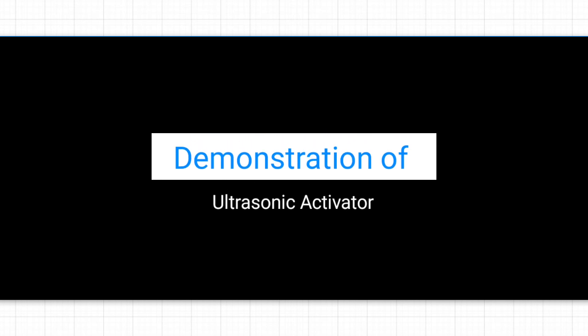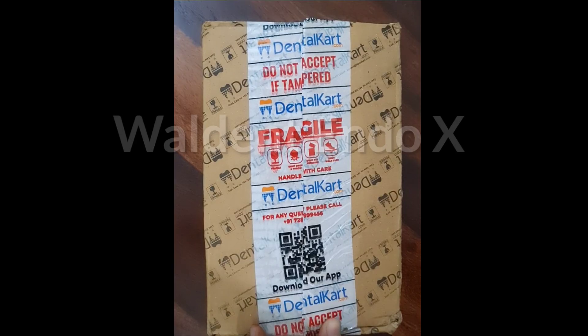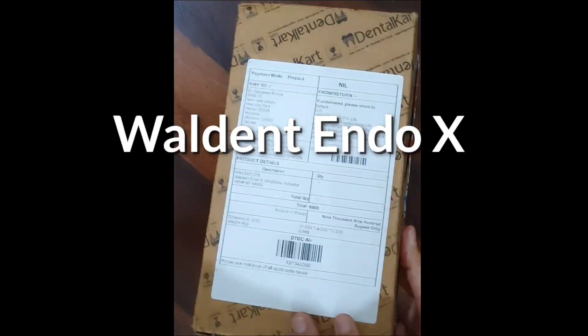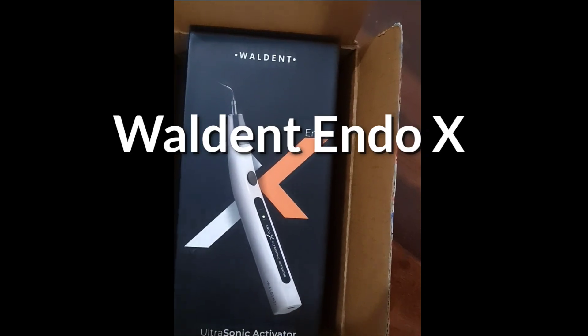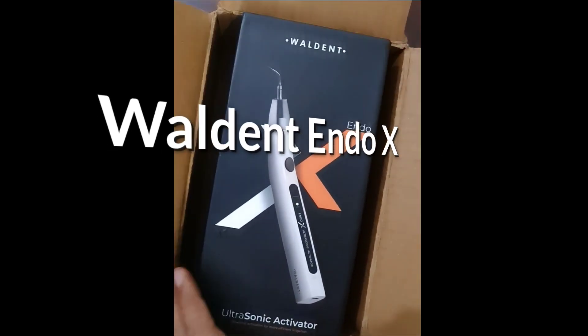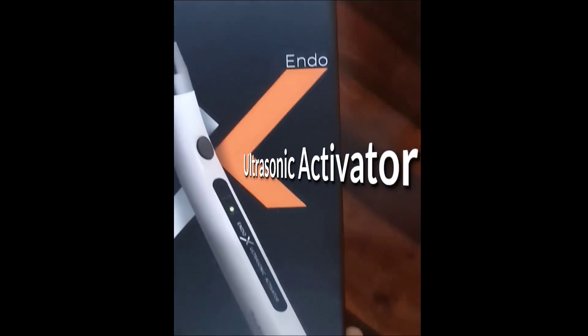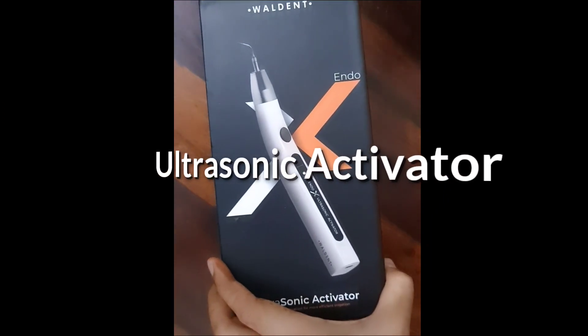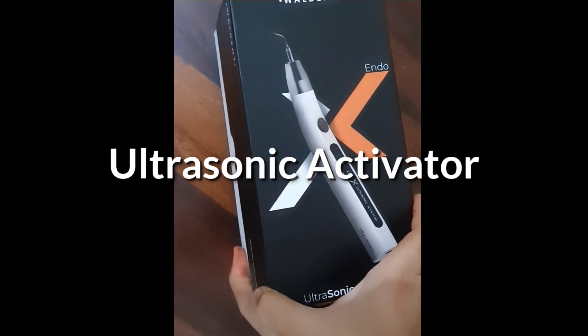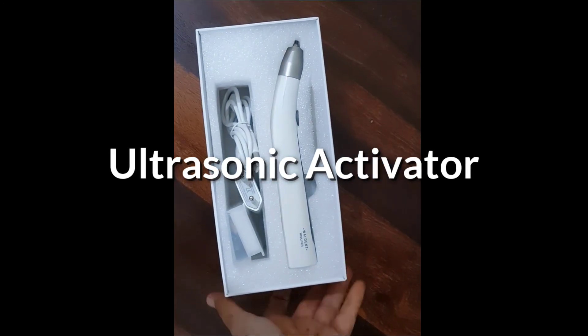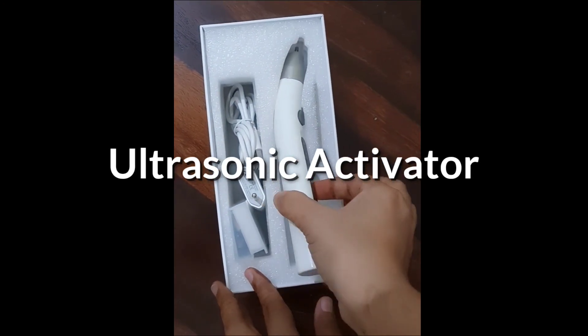This video is a demonstration of ultrasonic endo activator. Ultrasonic endo activator uses ultrasonic irrigation technology for deep irrigation of the root canals. It causes activation of the irrigating solution and helps in deep cleaning and disinfection into the lateral canal fins and the webs. For this video, I am using Waldent Endo X ultrasonic activator.